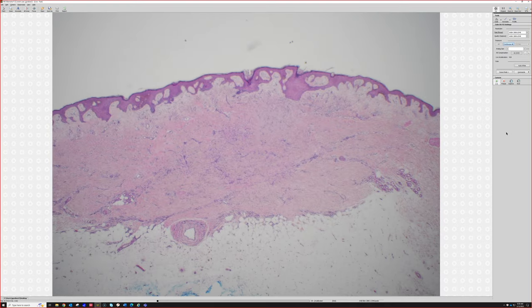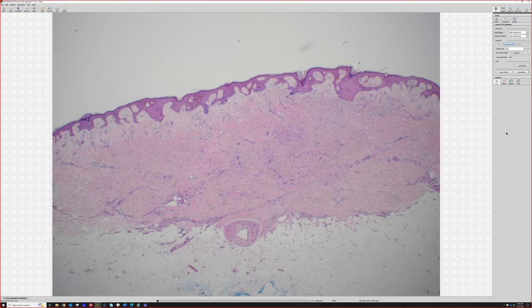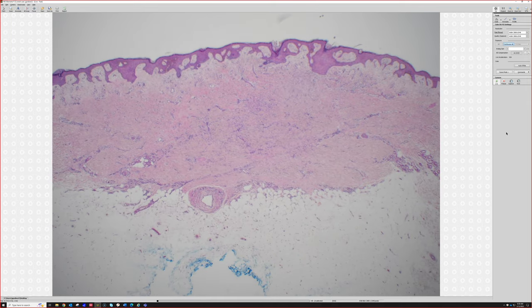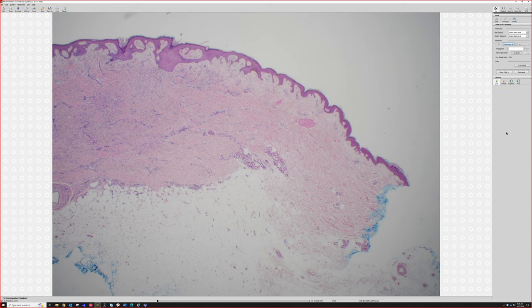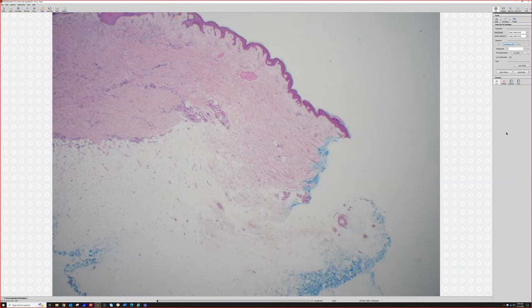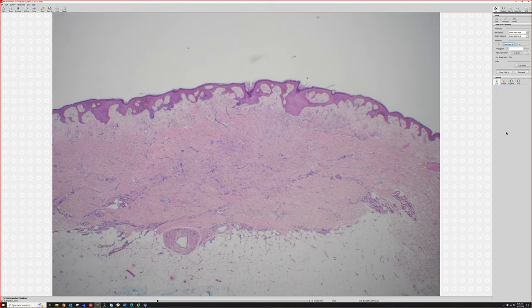Now how about this one. Here's the normal dermis — it's helpful to see the normal dermis and then the abnormal dermis, because dermis is hard to evaluate the collagen and the cellularity unless you have normal to compare it to. With practice you can recognize it, but even for me, if I get a punch of all abnormal dermis and it's subtle, it can take me a few seconds to pick up on it when I first look at the slide. It's a lot more noticeable when you can see the normal collagen pattern and then this.